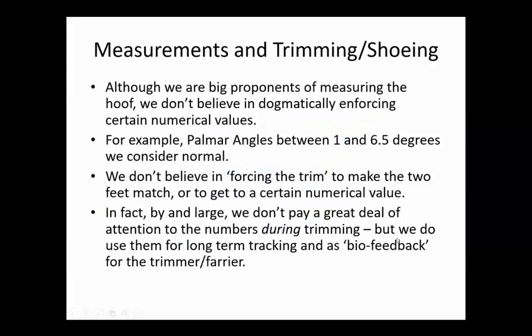Okay, so that's the Point Cam, which we're now using to take hoof photographs. Full disclosure, we're not as good as the 4% error rate that I talked about in the radiographs with the photographs yet. For the radiographs, we successfully trained the system on 240,000 images. For the photographs, we only have photos taken with the Point Cam since we invented it, which was last November. So we've only trained on a few thousand images, but it's going to get better. We keep getting more data and retraining, and it gets better and better.